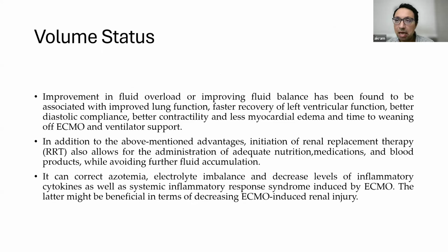However, we always think about removing the extra volume in patients with lung injury and cardiac patients. So in ECMO patients, we sometimes want to remove the fluids to the dry weight. This enhances the heart and lung recovery, and may shorten the duration of the ECMO run if used appropriately.